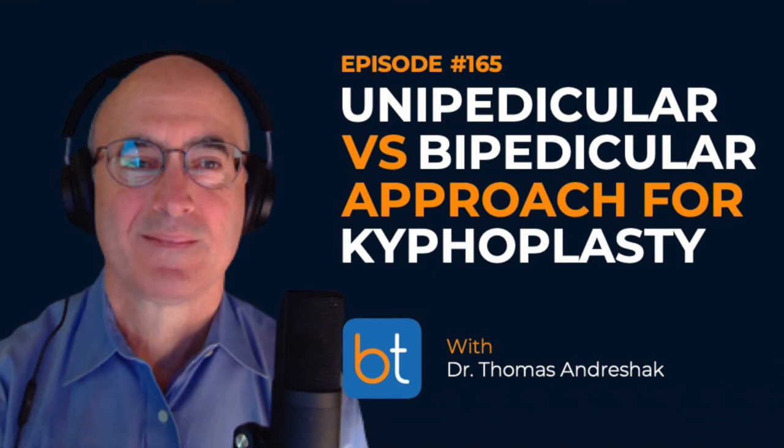Tom, for the listeners, what is the Kyphon assist? So Kyphon assist is basically a scooped cutout cannula, same as your size 2 or size 3 cannula. And it acts as a ramp, so the balloon gets directed to a certain area. It helps increase height reduction, and it controls your flow of the cement. Do you still do a single inflation when you're using the Kyphon assist, or will you ever direct it to the top or the middle or bottom, inflate more than once? Both. If I'm too lateral with my needle or catheter, I can use the Kyphon assist or scoop to push it more medial. If I'm too low, I can push it high. And sometimes I will bail out and go to the Kyphon assist because it makes my fill better. So each of those are great options and great tools that I think people need to know about in doing vertebral augmentation. I'll ask my rep this week.